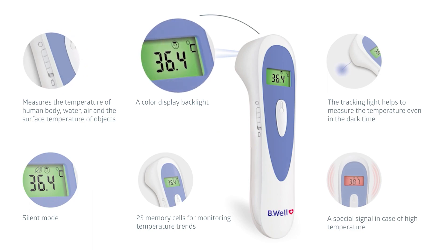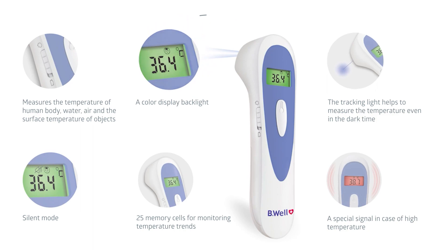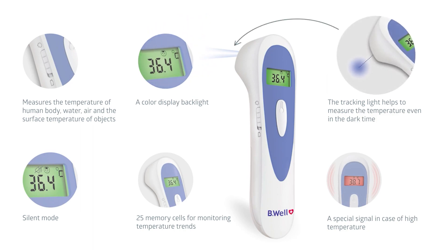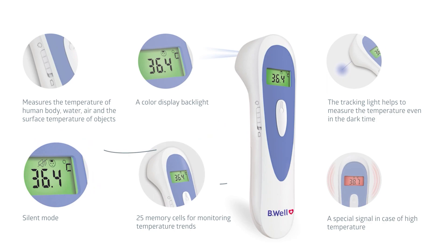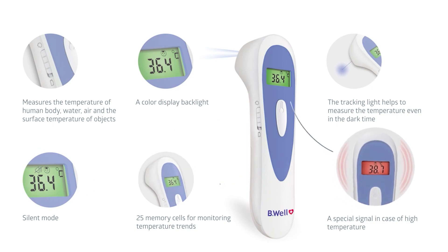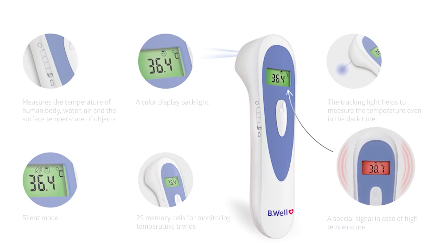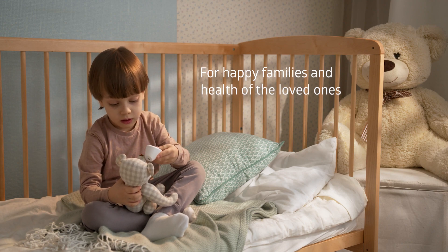Med 3000 is equipped with a colored display backlight which signals the level of the measured temperature. The blue LED tracking light helps to point the thermometer correctly during the measurement. In order to avoid disturbing your baby's sleep, sound notifications can be turned off. 25-measurement memory allows regular monitoring of temperature readings. A special signal will notify you that the body temperature is high. Be Well makes taking care of your loved ones' health convenient and easy.